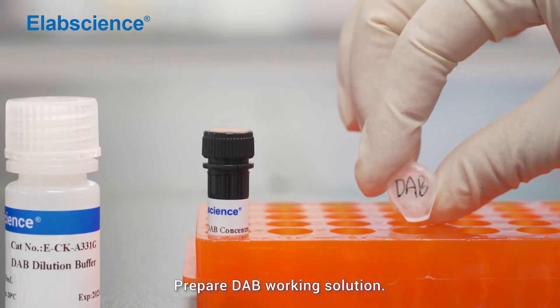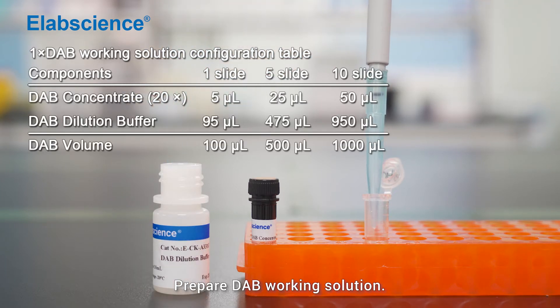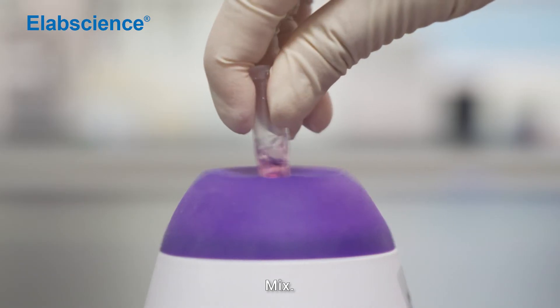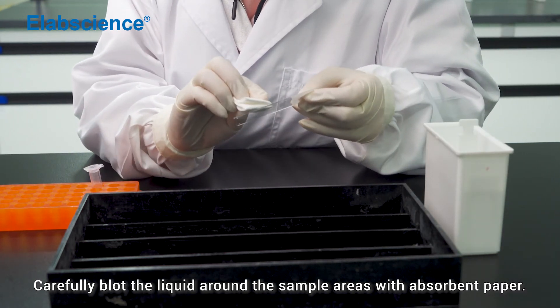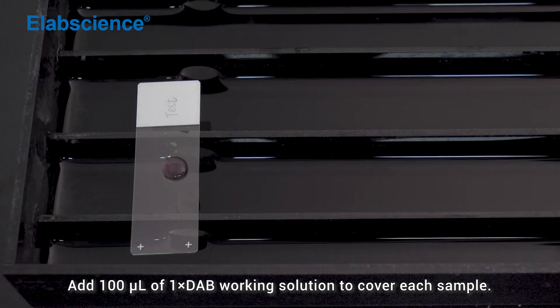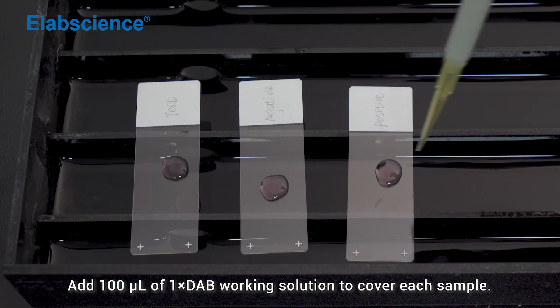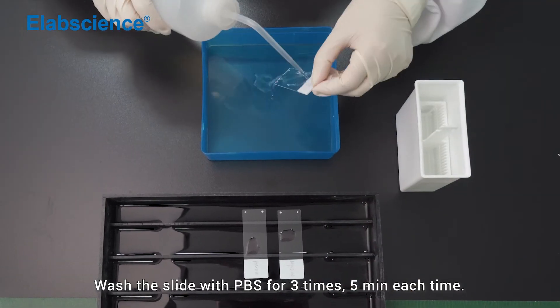Prepare the DAB working solution. Add 100 microlitres of 1x DAB working solution to cover each sample. Incubate at room temperature for 30 seconds to 5 minutes. Wash the slide with PBS for 3 times, 5 minutes each time.